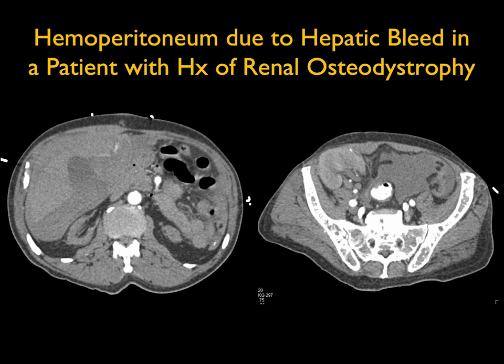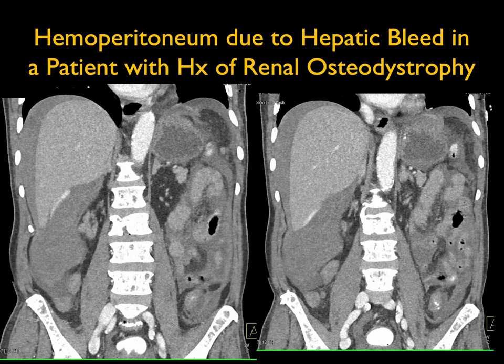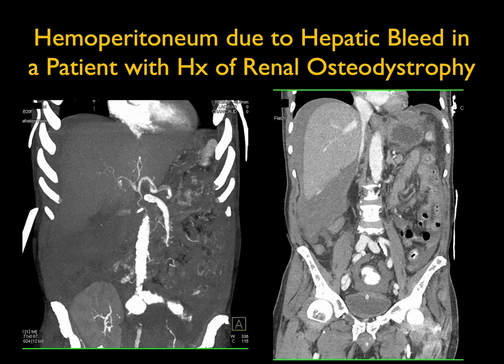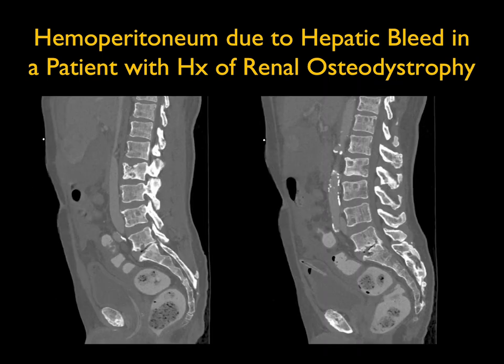I don't see a mass here but I do see active bleeding tracking around the right lobe of the liver. The renal osteodystrophy is visible in this patient with end-stage renal disease and a renal transplant. The patient did have trauma, which was likely the cause of the hepatic bleed, and the patient did well long term.